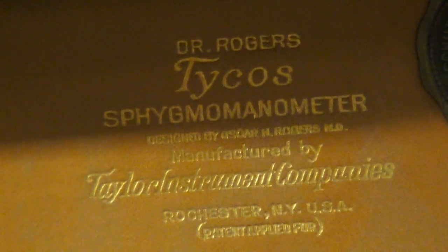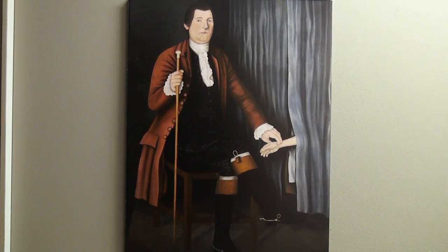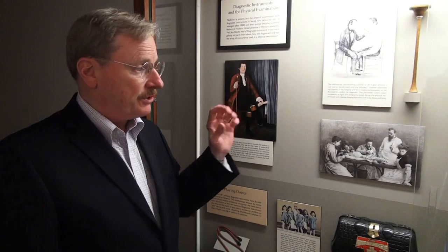In 1800, doctors used almost no instruments whatsoever — here we have a doctor simply holding somebody's pulse. But by the mid-century, the stethoscope was well in use, and by the end of the century, a whole array of technologies were being incorporated into medical practice.